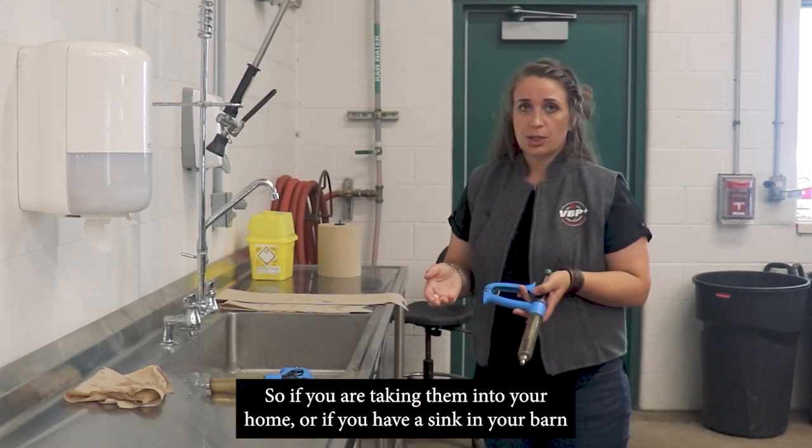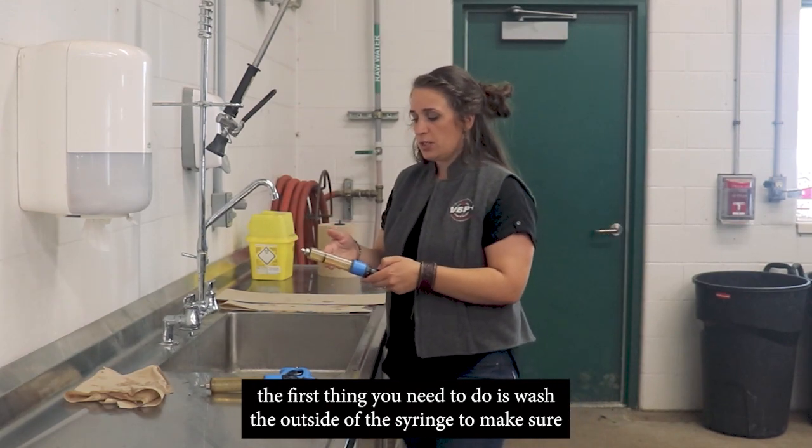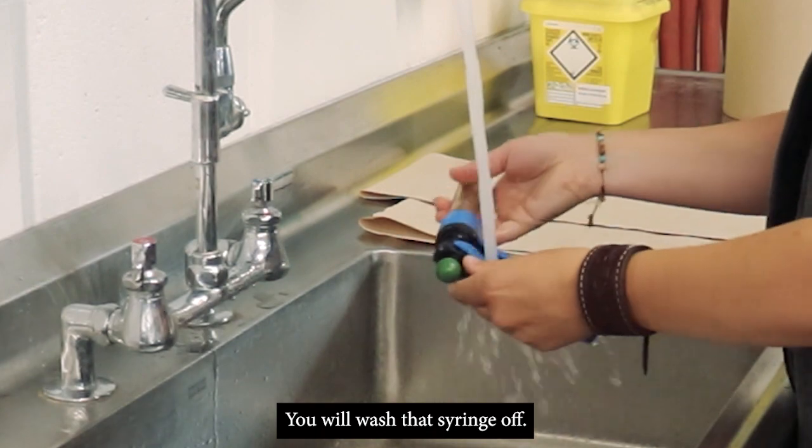So if you're taking them into your home, or if you have a sink in your barn, the first step is to wash the outside of the syringe just to make sure you get rid of any residue from the area you were working in. We'll wash that sprayer off.